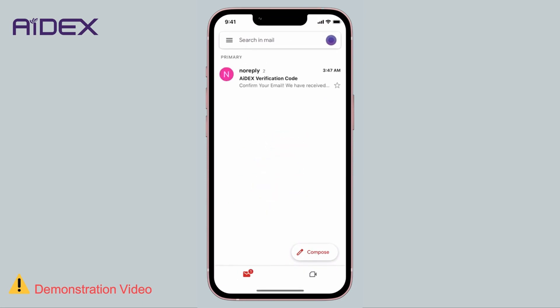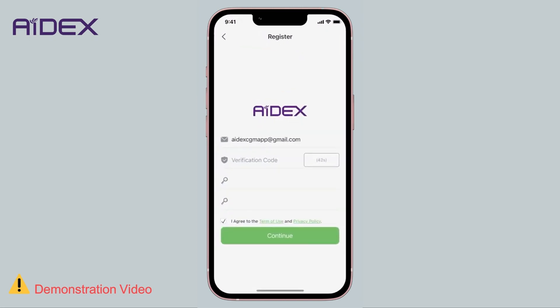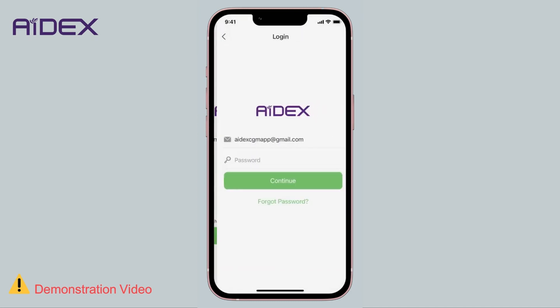Check your email. You should have received a message titled 'AiDEX Verification Code'. Enter the code in the app and click Continue. The app will then return to the login page. Enter your password and click Continue.